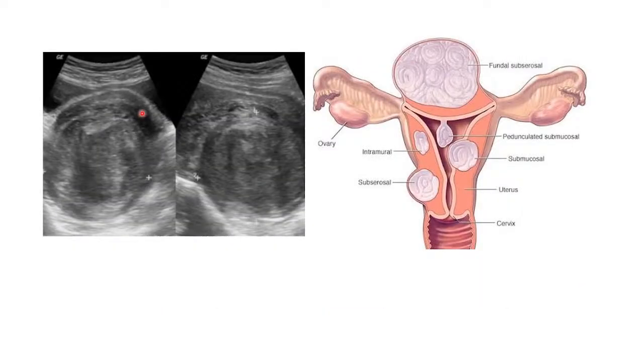So again, this is another fibroid there. You can say it's a giant fibroid. Okay, the mass effect of the fibroid. So it is this mass effect. You can see that it's compressing the cervix there.